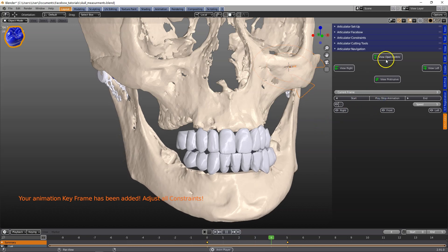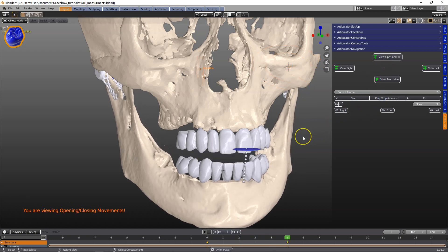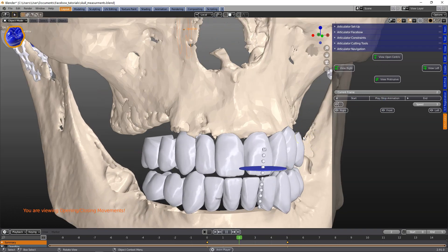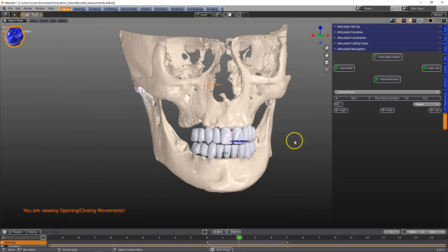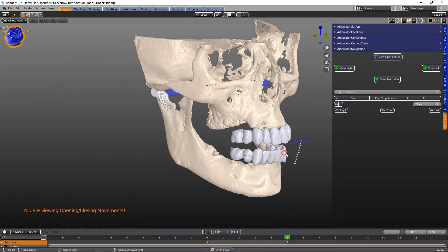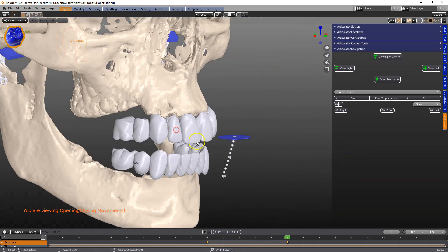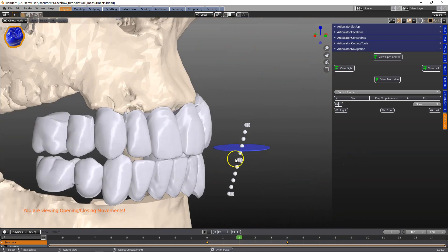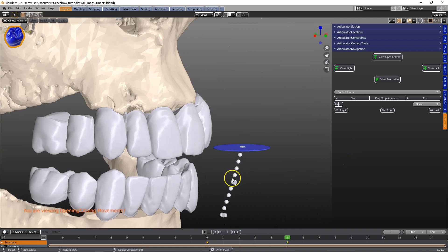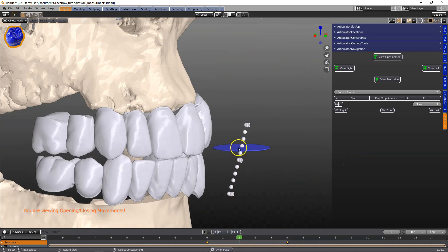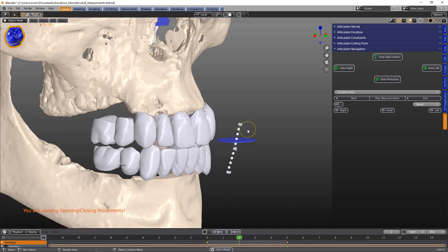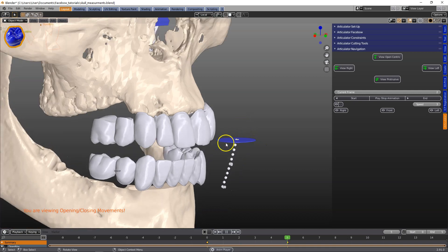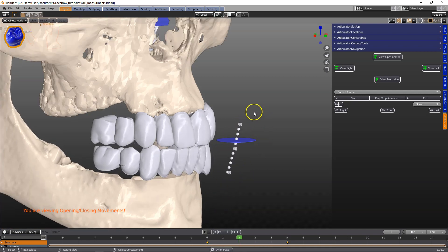Let's play the animation opening and closing the jaw. The little front piece is the incisal pin, and that equates to a dental articulator. You can see that it's between 0 and 10, so this is 10 millimeters opened up in articulated terms.